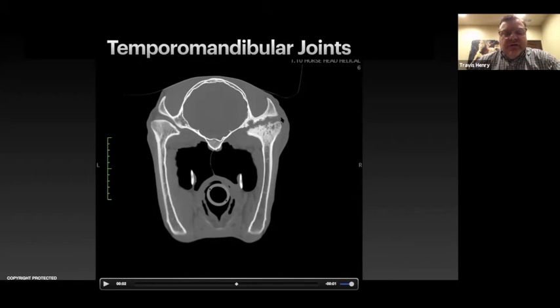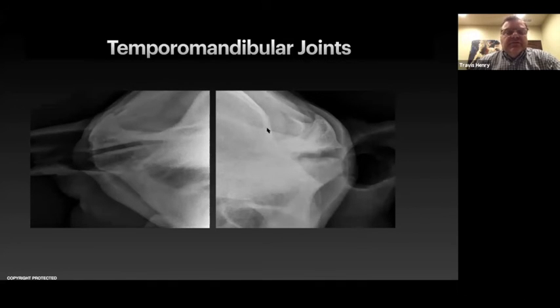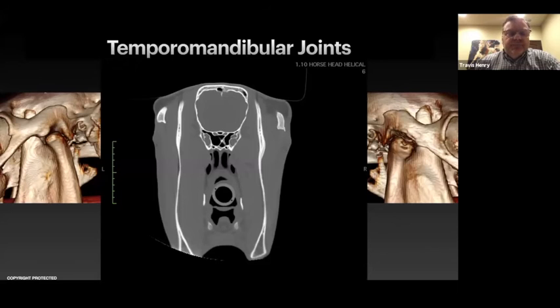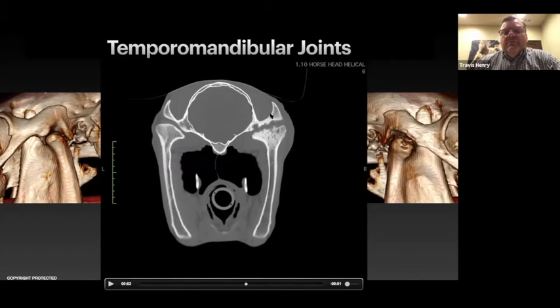They were very nice. And so we started with just imaging the temporomandibular joints with plain radiography, and then I tapped this temporomandibular joint because I could tell that there was some increased swelling over it, and cultured it, and we grew a strep zoo from that temporomandibular joint. So this was the films of this horse, and we can see the normal left temporomandibular joint here in a 70-degree tangential view, and on the opposite side we can see that there is a problem with this temporomandibular joint. We've got erosion, we've got osteophyte production, but realistically, until we CT'd the horse and looked, we wouldn't have realized that all of this was going on.